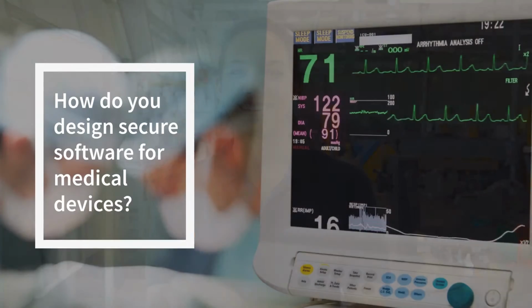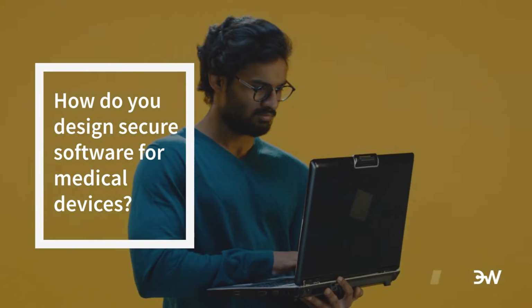How do you design secure software for medical devices? We've got several different levels of security we've got to consider. I guess the most obvious one is, do you need to secure the software on the device? You need to ensure that the software that the device is running is valid software for that device. It was produced by someone who is authorized to give you software for that device.